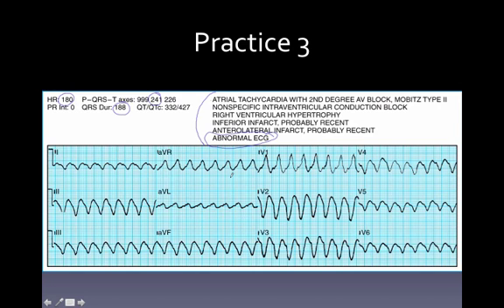Please check your work. You cannot trust the verbiage that is spit out by the Doc in the Box. This stuff over here is highly accurate. If you have your leads placed right, then you can pay attention to this every day and twice on Sundays. This stuff over here, it's a coin toss.